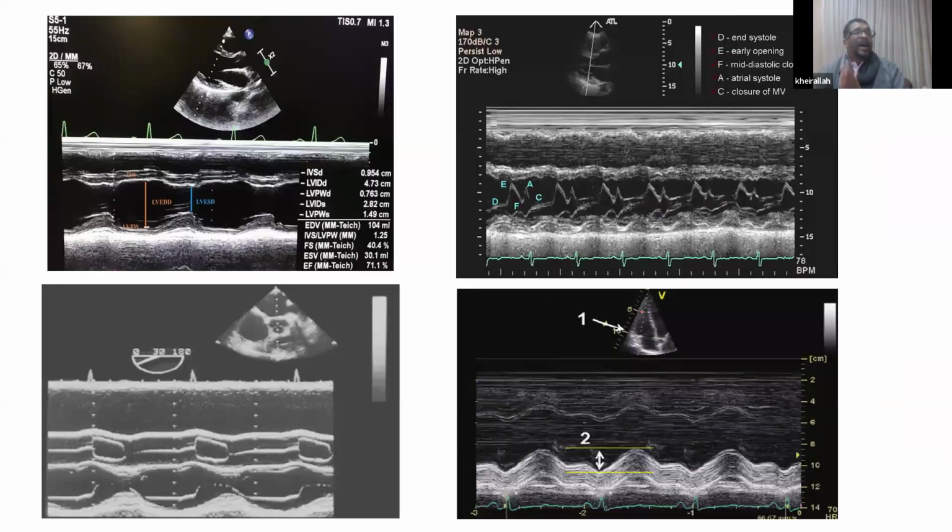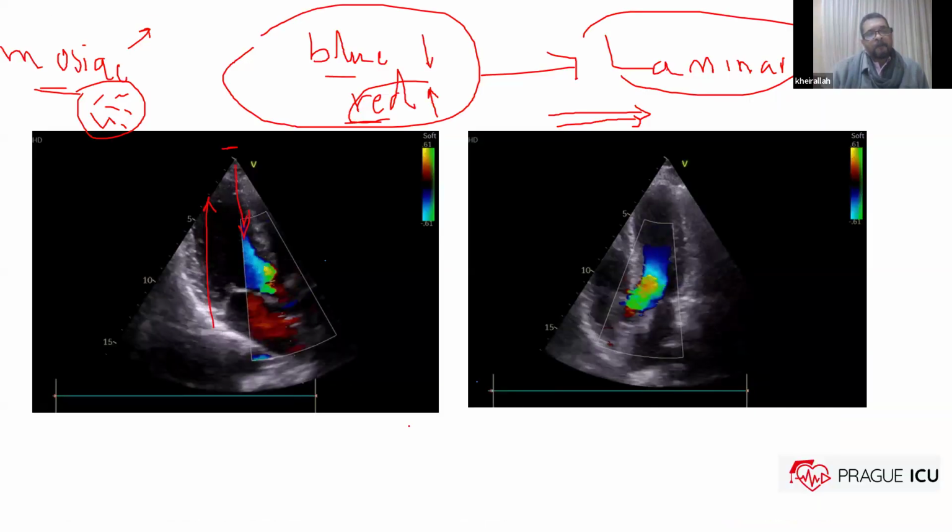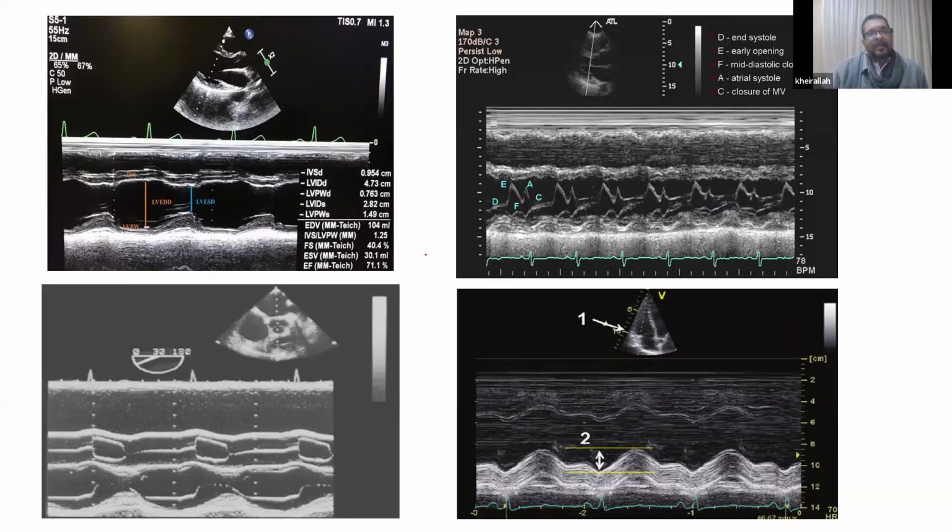Okay. We also have M mode. And whenever you hear the word M mode, it stands for motion mode. M mode, I want you always to remember one word about M mode, which is what? Can anybody guess? Anybody can guess? Something related to the resolution.